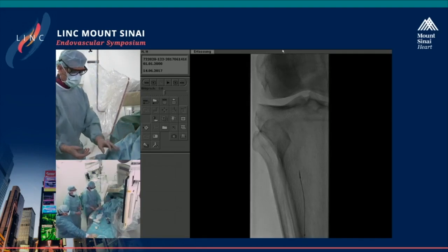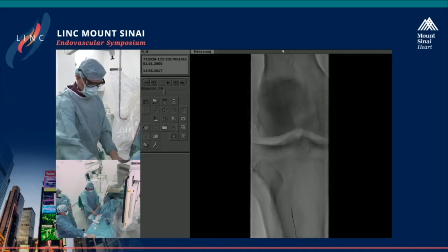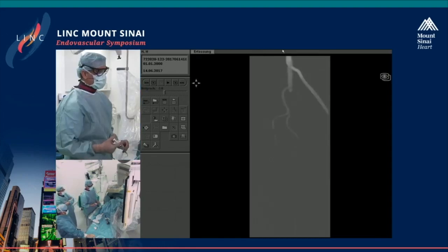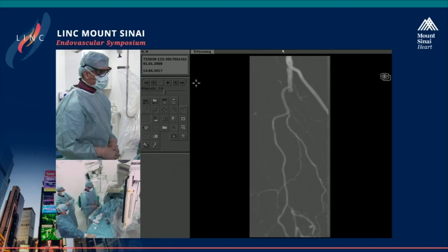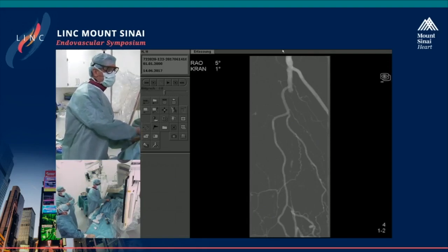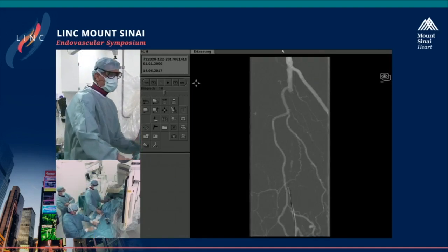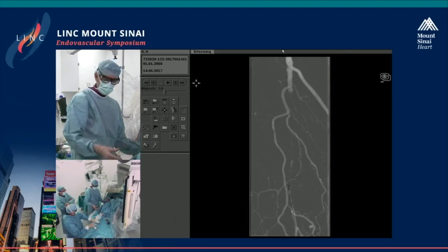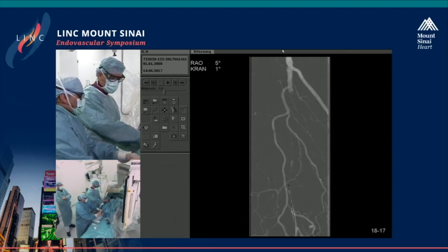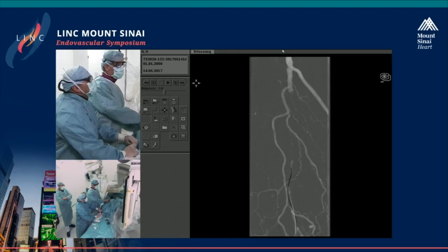Okay, you see here now, this is here a CXI catheter. Through that CXI catheter, I can exchange from an 014 wire to an 018 wire, whatever. Give a roadmap here from retrograde, and I think we are on a good way. Maybe, Marco, what do you think? You want to push the wire here a little bit in? Or? I think you are in a good position. Yeah. I hold the catheter, and you push the wire a little bit, because this CXI is a little bit slippery, so I need to hold it. Yeah, please. Let's take it in. Yeah, good way.